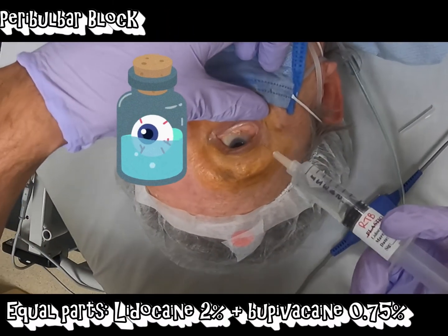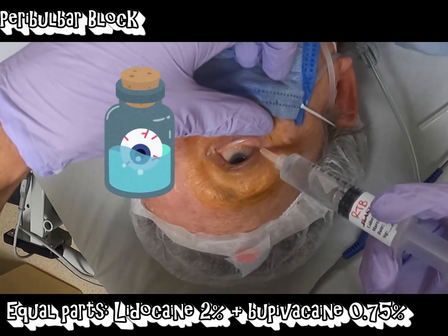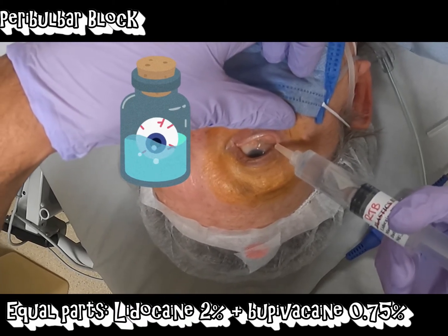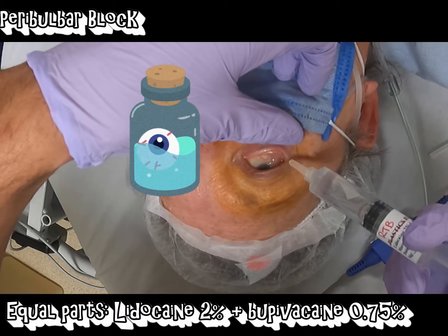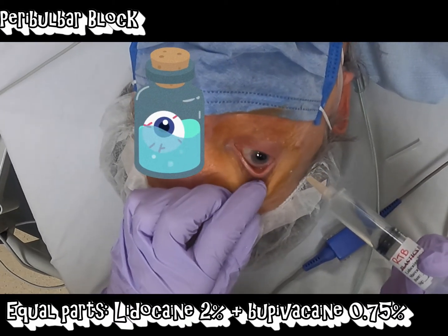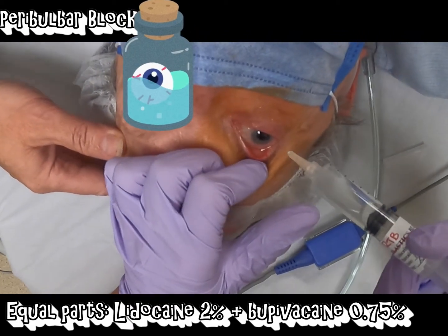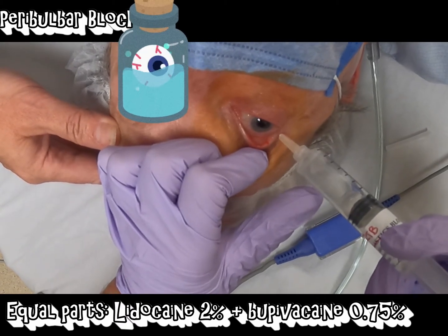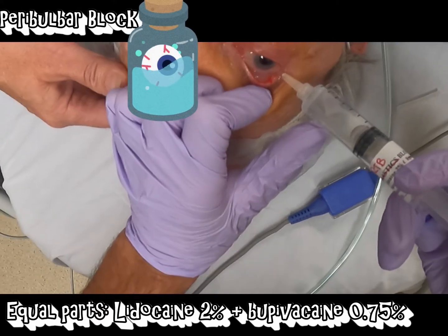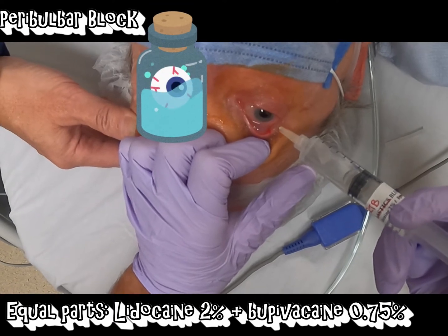She's on an anticoagulant, so we are going to avoid the retro-bulbar block and instead do a peri-bulbar block. The majority of this block is just for comfort during the procedure, but even more so for comfort after the procedure. It's completely okay in this situation to not necessarily be able to get the retro-bulbar block, although it does make it a little bit easier. So just a peri-bulbar block — just around the eye — that's elevating the conjunctiva.